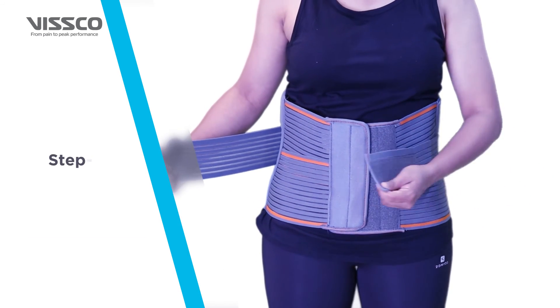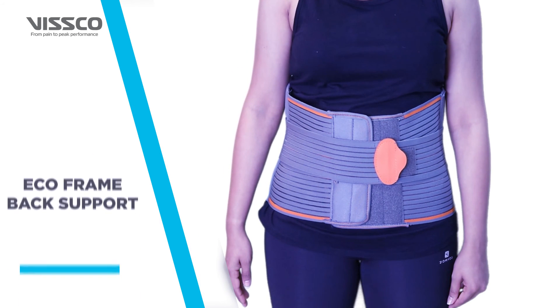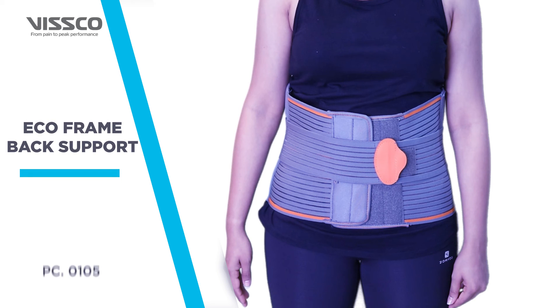Lastly, stretch and lock the outer straps for additional reinforcement. Congratulations! Your Wisco Eco-Frame Back Support is now ready for use.